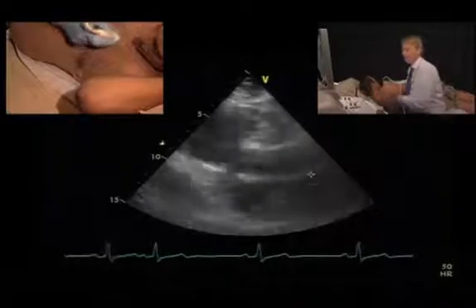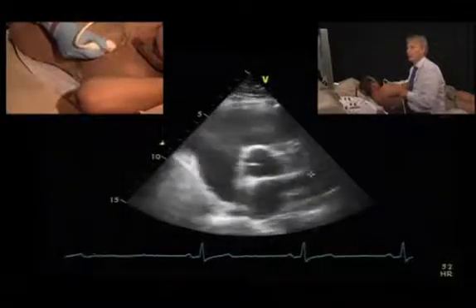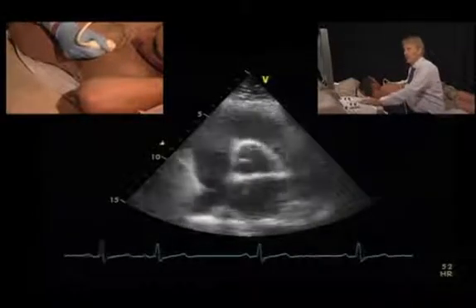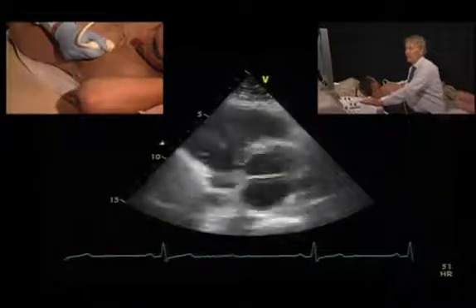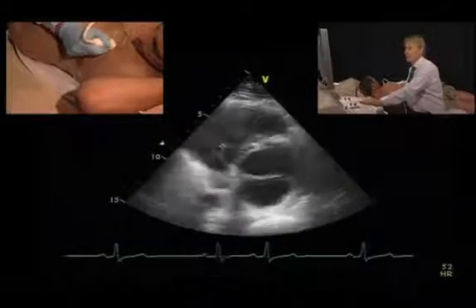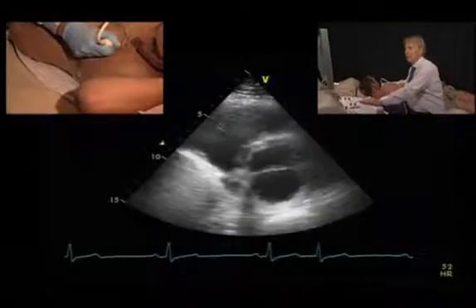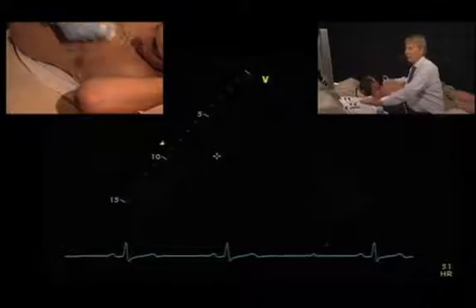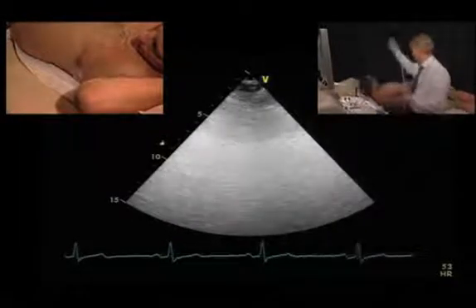The second view is the parasternal short-axis view. We are at the level of the aortic valve at the base of the heart. Here we have the tricuspid valve, and in this view it is often very nice to see the subvalvular apparatus — you can see the subvalvular apparatus of the tricuspid valve clearly here.